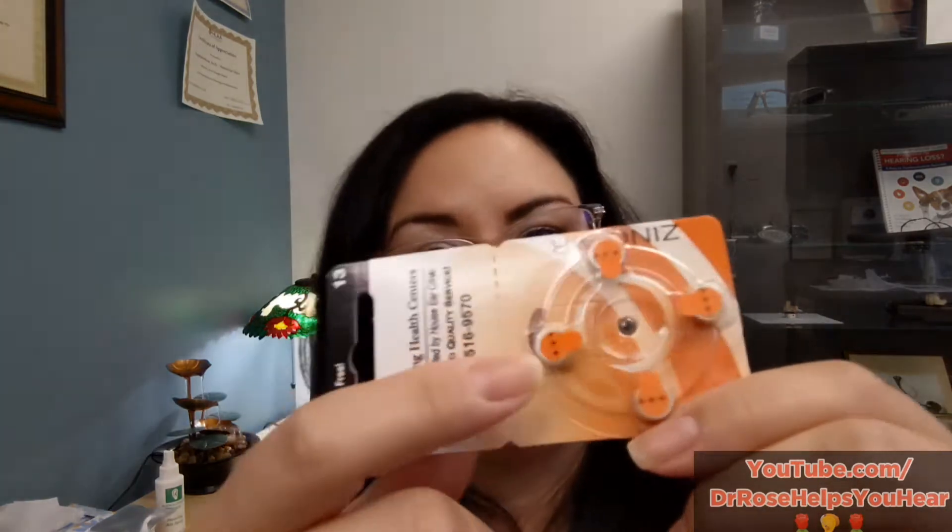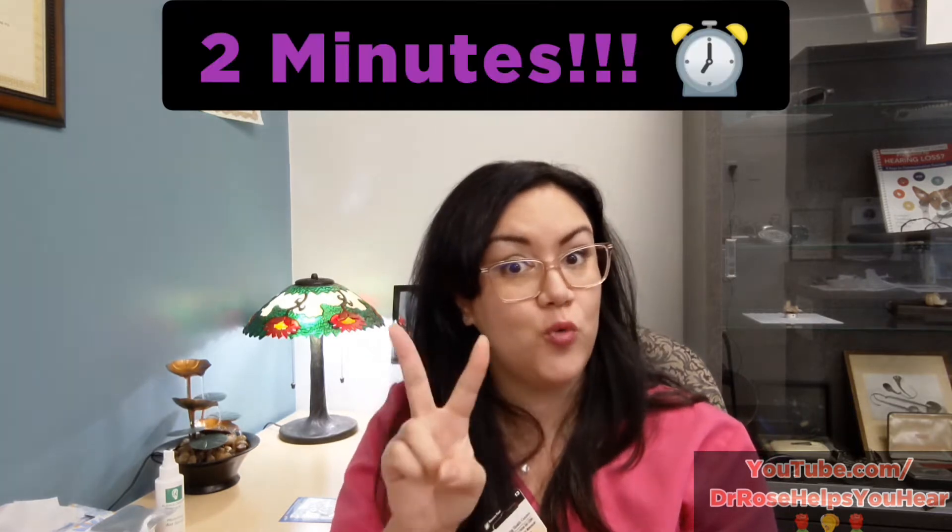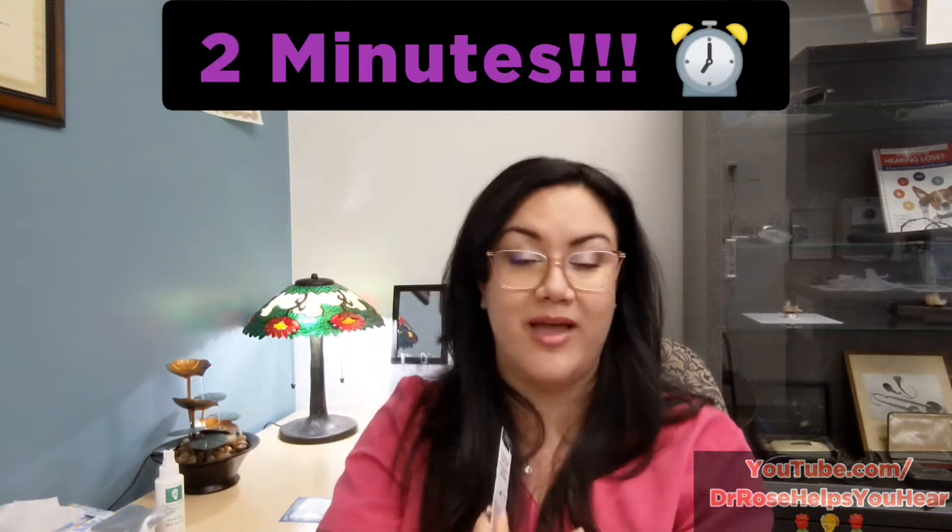One thing to note with zinc air batteries: they have little stickers that cover holes on the battery, which allow oxygen to come through and activate everything inside. When you peel the sticker, make sure you wait two minutes before closing the battery door or inserting it into the hearing aid. That way it will have its full power and work for as long as possible.